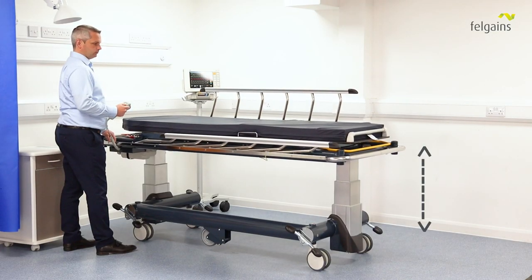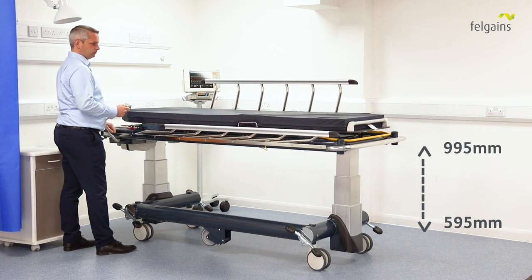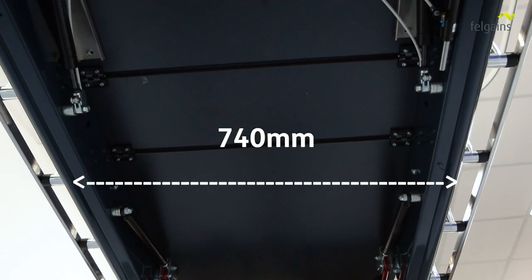The ImageFlow stretcher has an industry-leading 320 kg safe working load, making it suitable for bariatric patients. The mattress platform has a height range of 595 mm up to 995 mm and a width of 740 mm.